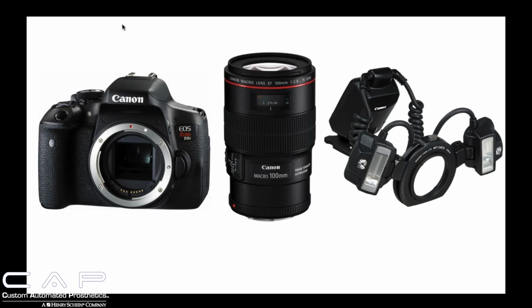But that's a very important feature. You can get away with maybe a 60mm macro lens. The one that I have here on the screen is the L series, which is the highest end glass, which is great, but it's not 100% necessary. The price difference between the L series and the more basic line is pretty significant.